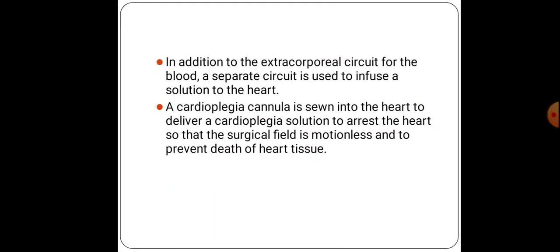The main purpose is to temporarily stop the function of the heart, so we use the cardioplegia solution to do that, so that the surgical field is motionless and also to prevent the death of the heart tissues.